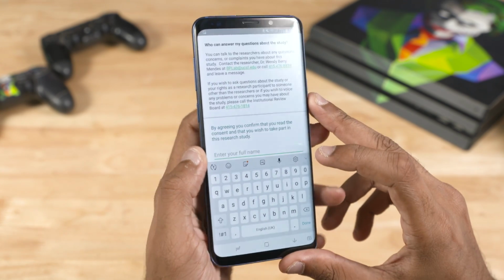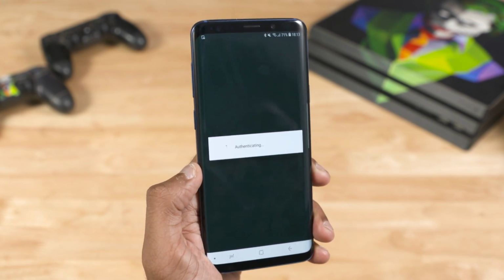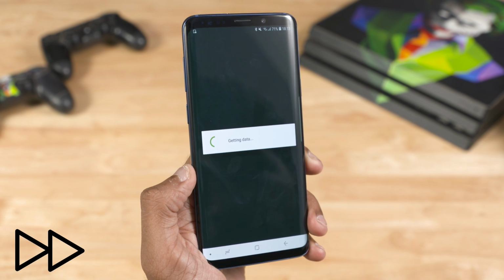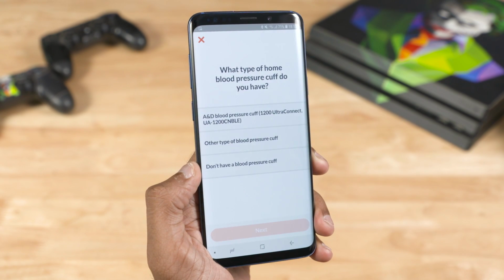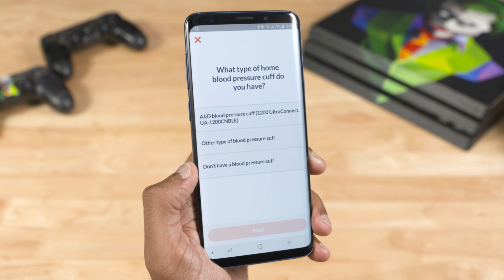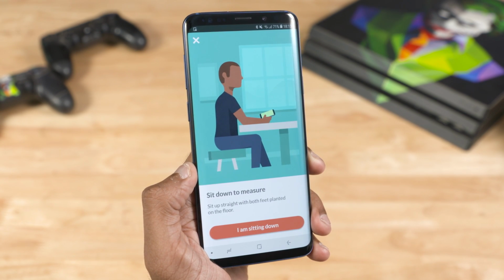Now with that out of the way, you have to register for research, fill some details, and finally your email. You should get a response within a few moments. Click on the link included in the mail and you'll now be able to start with the research project. The app would ask for a preliminary baseline reading from a blood pressure cuff. Since we didn't have one, we skipped the step and went on.